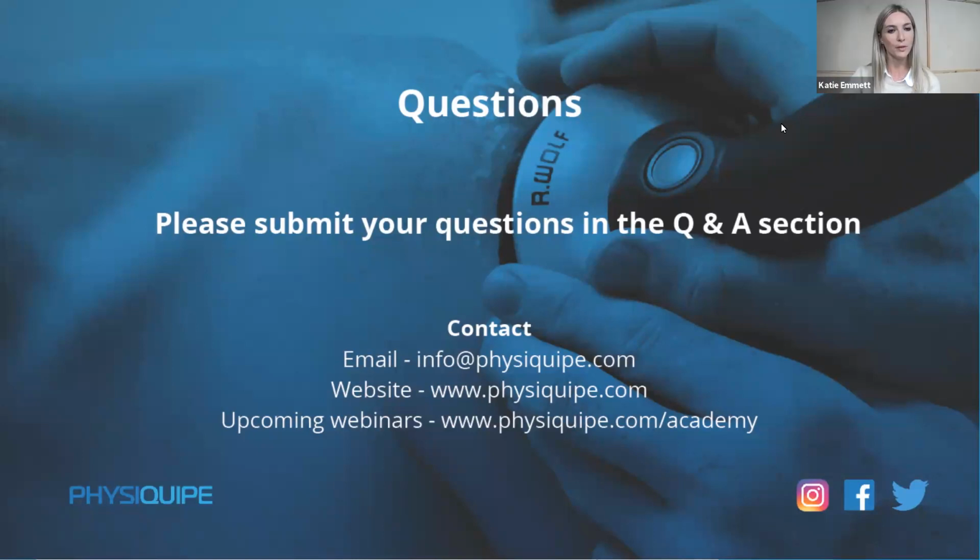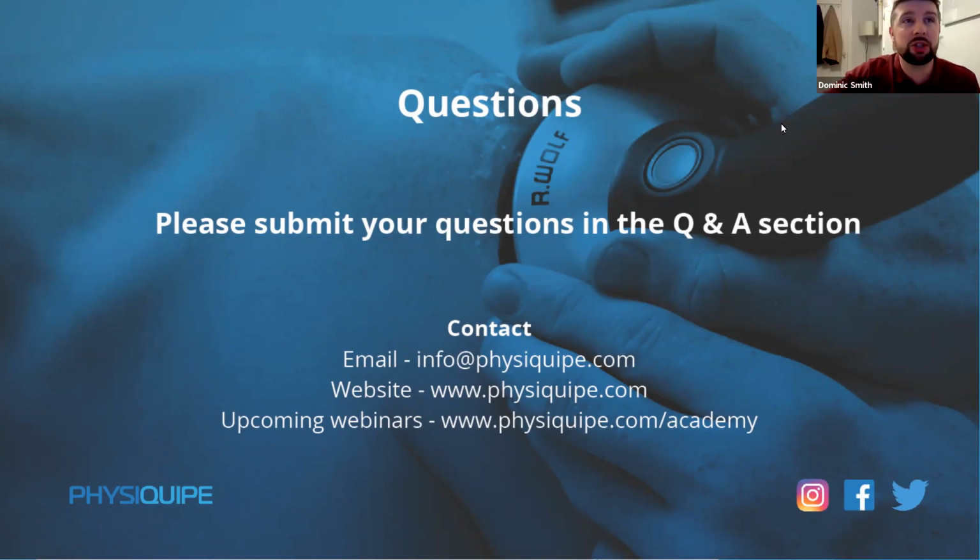Okay, great. So I'm going to cover a few more questions from Dave as well. The next question, where do you target in frozen shoulder? Usually where the patient is complaining of pain or where their restriction is. Let's say, I feel restricted particularly here. If I can get a pain response, that's where I'd hit. If you've got any radiographic changes that look abnormal, potentially look at hitting that as well. But I'm quite fortunate that I've got access to the linear source. So if it's not too much of a pinpoint area, I'll just use the linear probe. So I've got 4.5 centimeters of hitting, and I'll just work around the area.